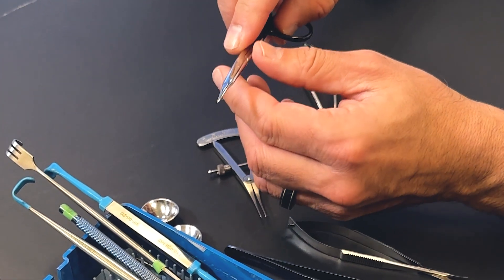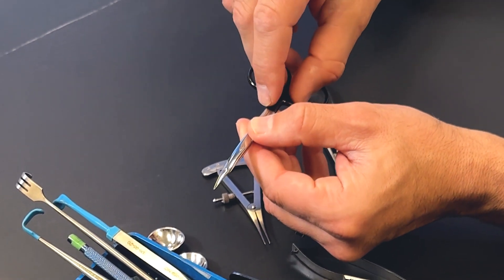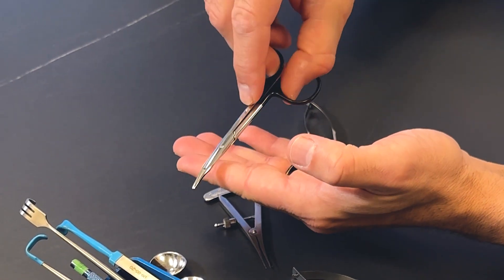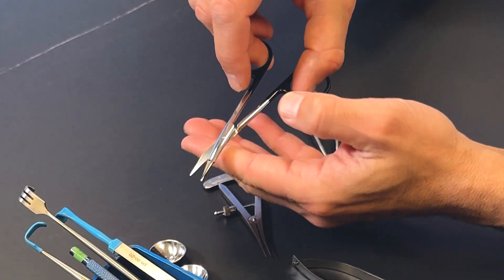There's various kinds of scissors I use. If I need to identify fat in the upper eyelid, I'll spread with these tenotomy scissors, and it allows me to gently spread, find the fat, and then gently trim it.